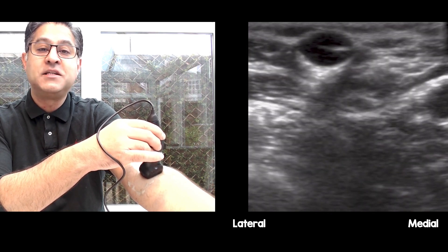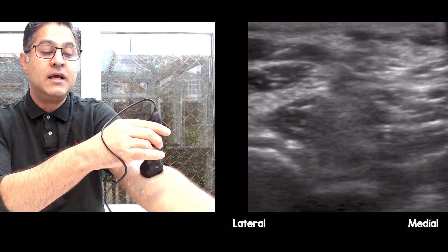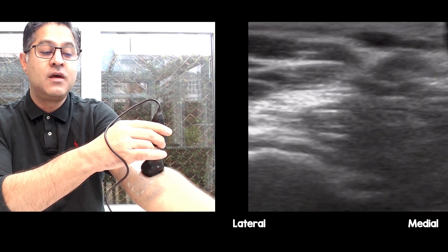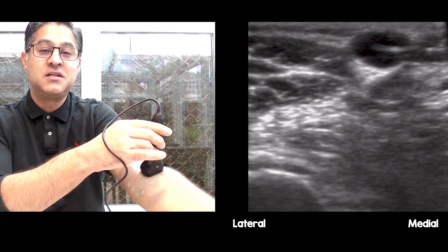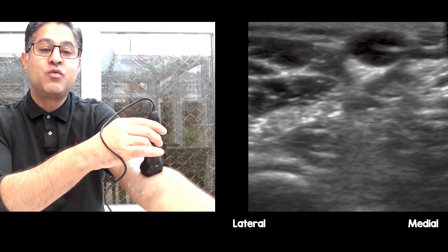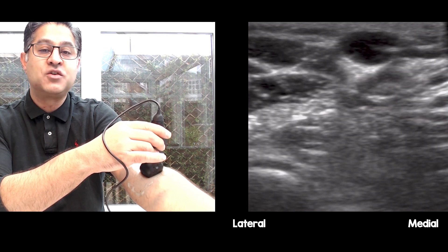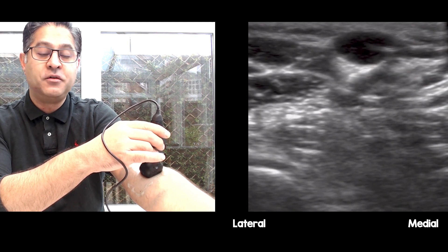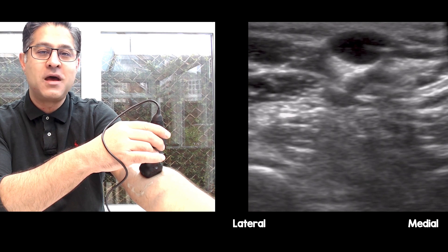Right underneath the cephalic vein, right in the center of the screen, that is the lateral antebrachial cutaneous nerve. So with one needle insertion you can block both the radial nerve and the lateral antebrachial cutaneous nerve — great for distal radius fractures where you don't want to give a full brachial plexus block. Hope that helps.